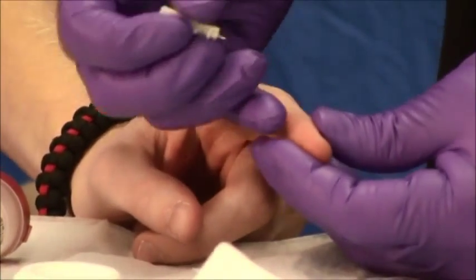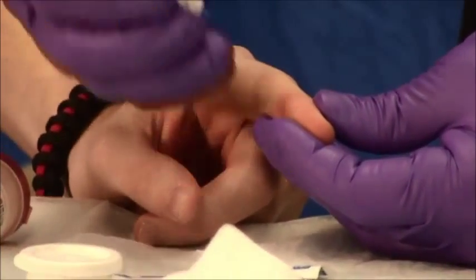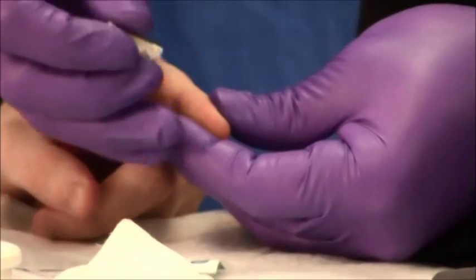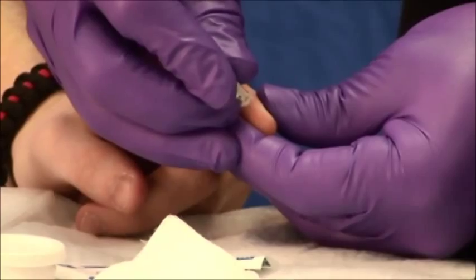Next, hold the patient's finger so as to squeeze the pad of the finger slightly. Take your lancet and aim for the center of the finger right in this area. Then warn the patient: 'On three you're going to feel a big pinch. One, two, three.'